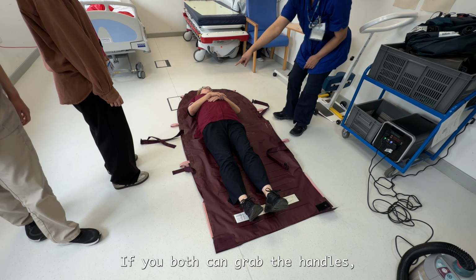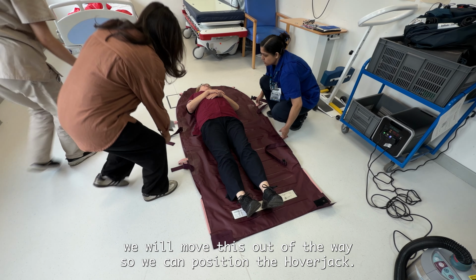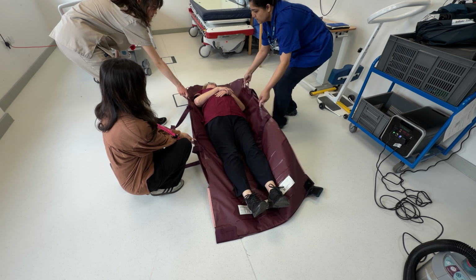Okay. If you both can grab the handles, we will move out of the way so we can position the Hoverjack.